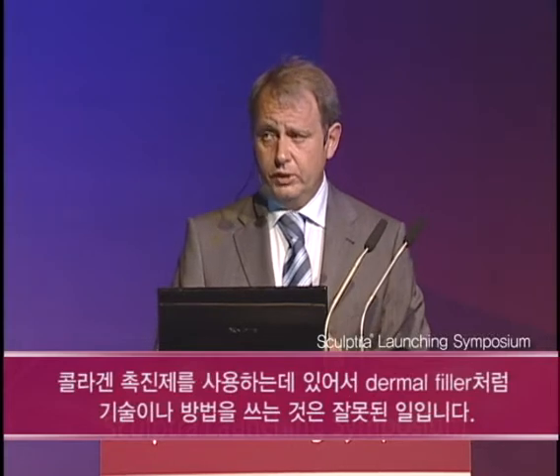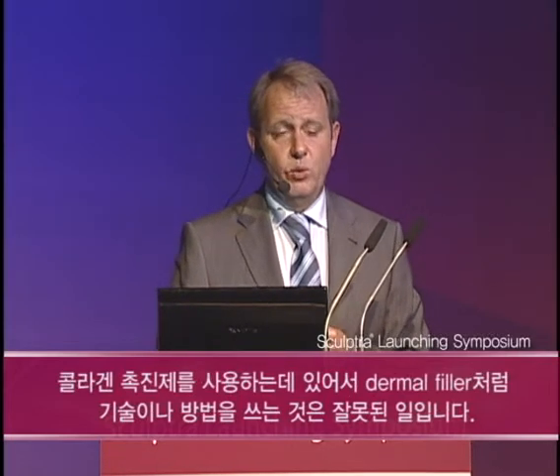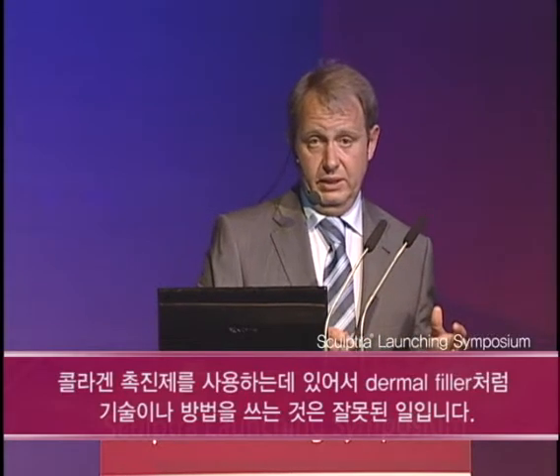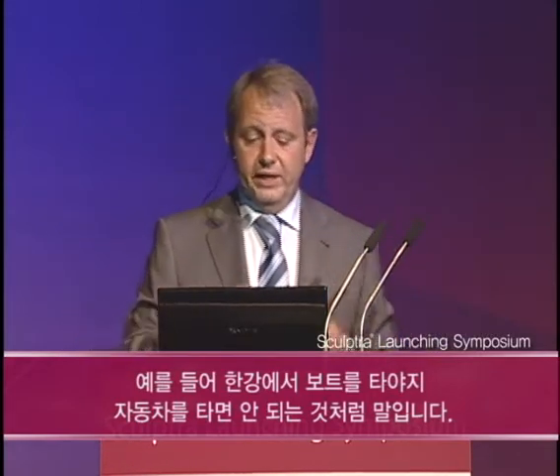We were not aware at that time that actually this was the first representative of the new group, as we know it by now, the group of collagen stimulators. And you can imagine that using a collagen stimulator with the technique and the methodology of a dermal filler is not right. It's like if you want to drive with your car here on the Han River. That doesn't go, you need a boat. So we learned a lot from that period.